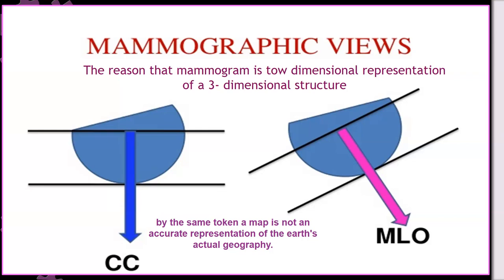Yes, the reason mammography is done in two views is to provide a two-dimensional representation of a three-dimensional structure. As you have seen here, looking from two different views makes it seem like three dimensions, but it is not exactly so, like a flat representation of the earth.